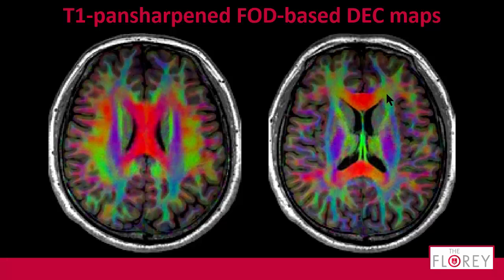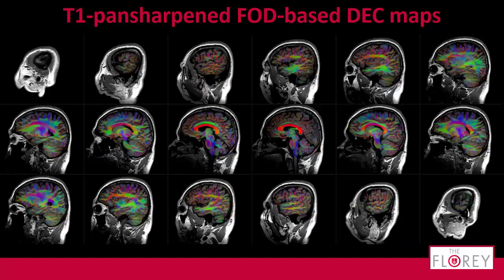For instance, here, you should see something that is yellowish, which is a mixture of something reddish and greenish. But at least it provides a continuum and no weird, fake, false boundaries. Other mixtures as well, for instance, here, are also pretty nice. Things that are interdigitating. You can now see them both if you do have the anatomical context, of course. That's important. Well, you can do now everything with it.